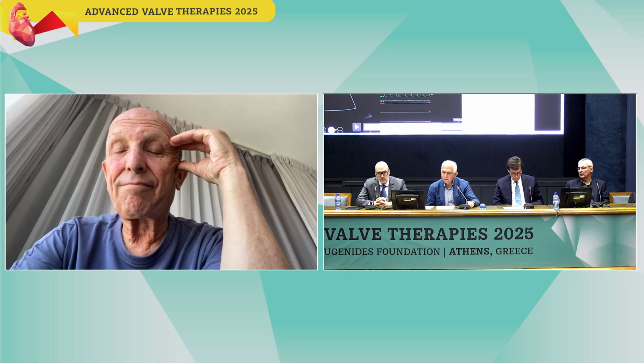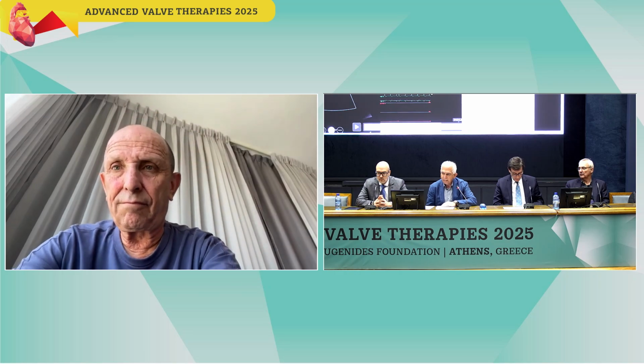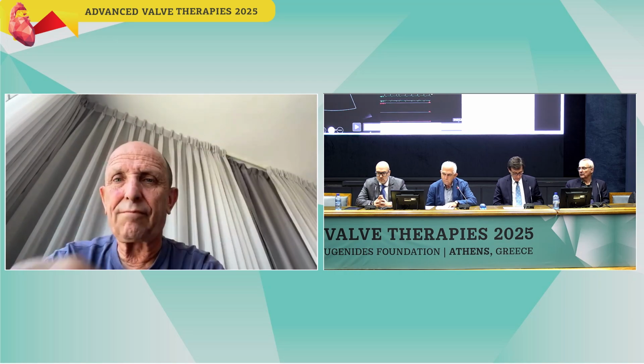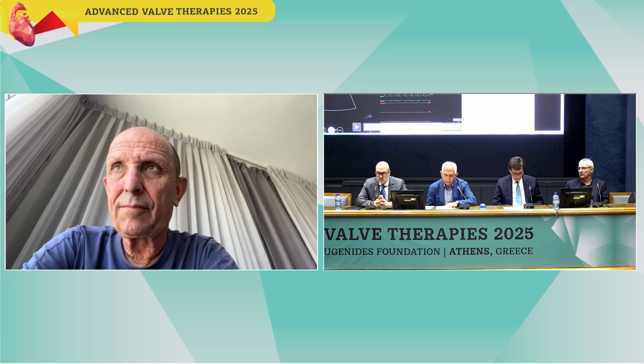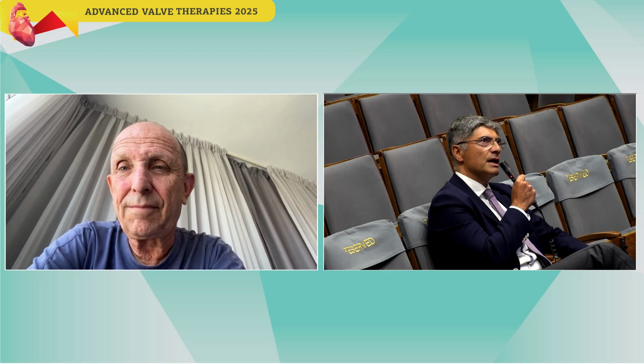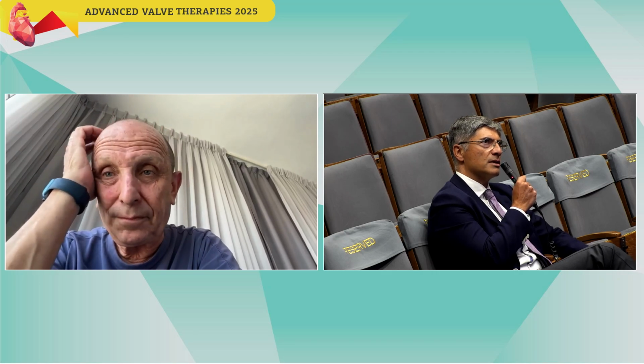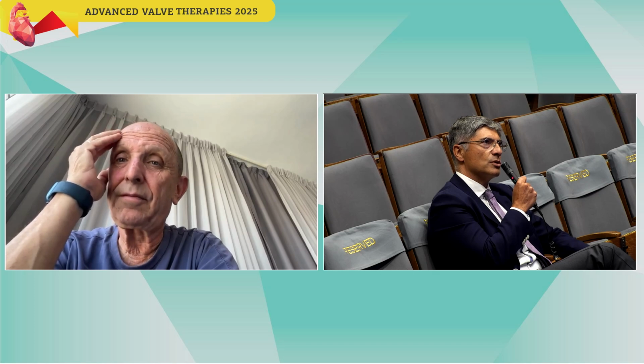Arik, thank you for your comment. Actually, we were doing the procedure in the way that we learned from you some years ago. So I think we were very cognizant of the LVOT calcification. That's why we were a little bit moderate in the pre-dilatation.